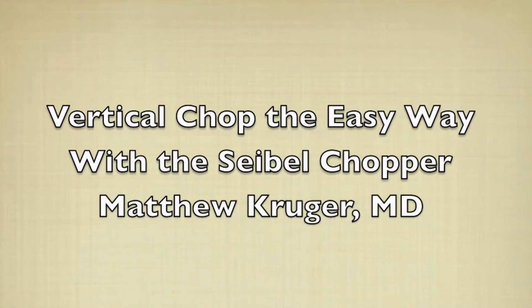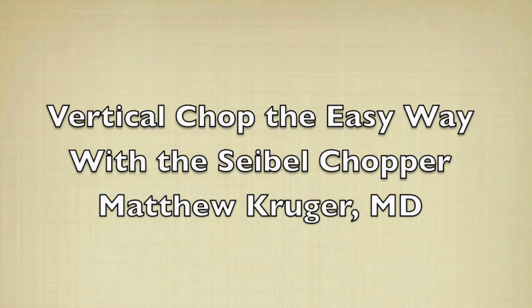In this video, I'm going to demonstrate my way of performing vertical chop with the Seibel Vertical Chopper. I first saw vertical chop as a second year resident performed by Wayne Bowman. Seeing the nucleus seemingly fall apart with minimal effort really caught my attention and inspired me to learn it as quickly as possible.